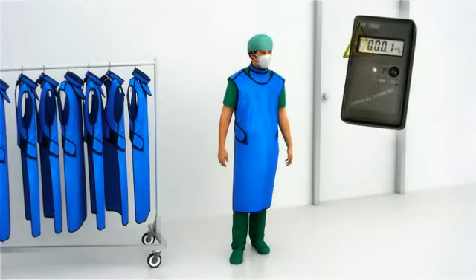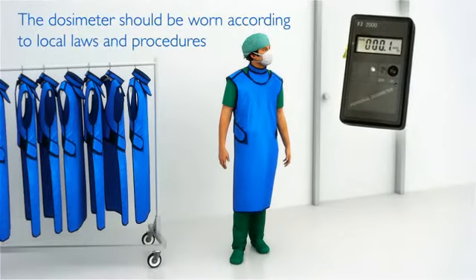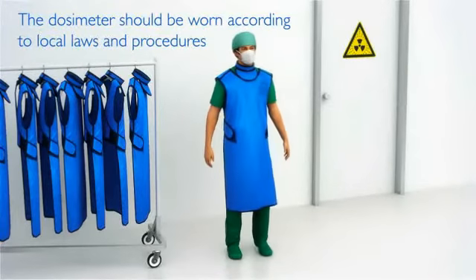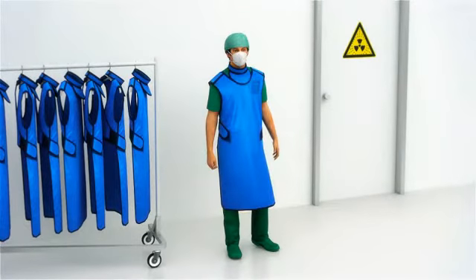By wearing a dosimeter, the overall radiation dose will be monitored. The recommended safe limits can be obtained from the local guidelines. The dosimeter should be worn according to local laws and procedures.